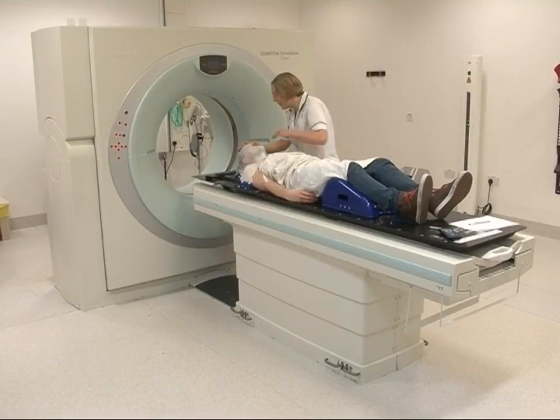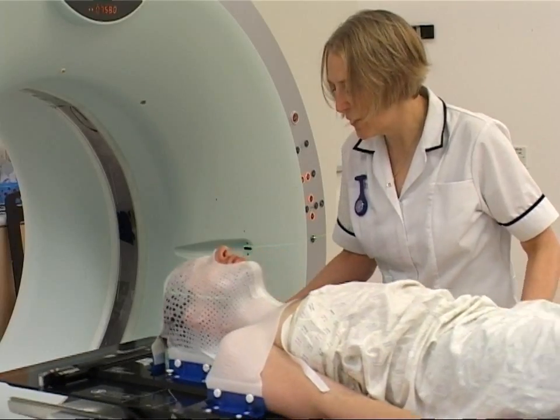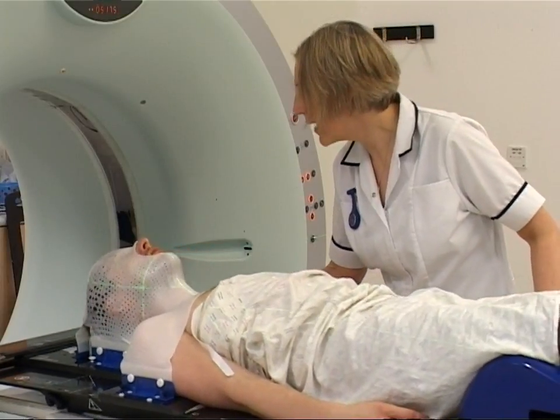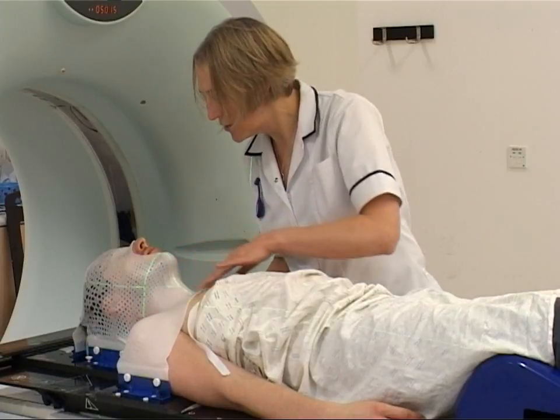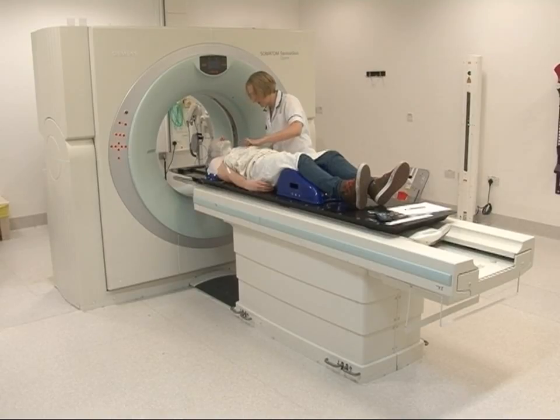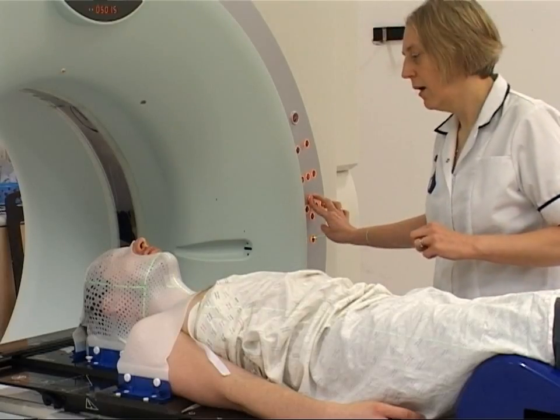Once your mask has been made, you will need a planning scan. This scan helps the oncologist and medical scientists plan your exact radiotherapy treatment, showing them which areas need to be treated.